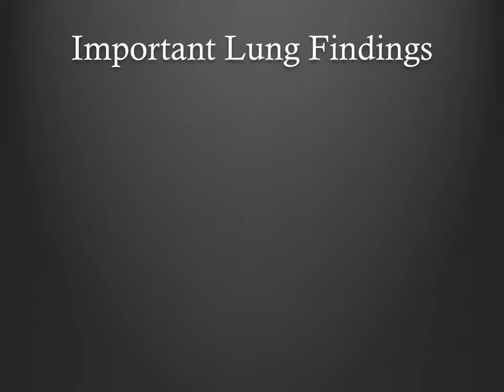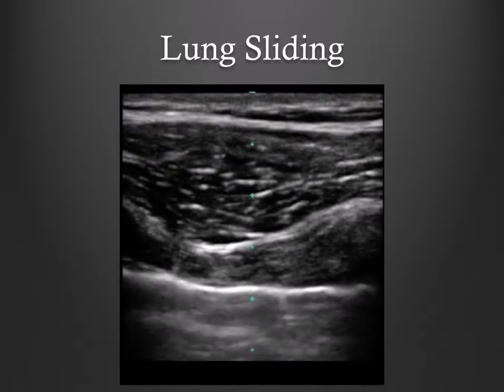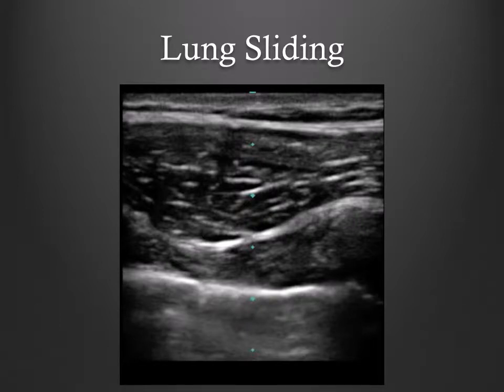Lung artifacts follow consistent patterns in specific disease states. The pleural line, seen on ultrasound as a hyperechoic horizontal line, moves in sync with respiration, resulting in lung sliding, which is the movement of the visceral against the parietal pleura. This video shows the glistening or shimmering of the pleura, where each white pixel of the pleural line changes to shades of gray throughout the respiratory cycle.